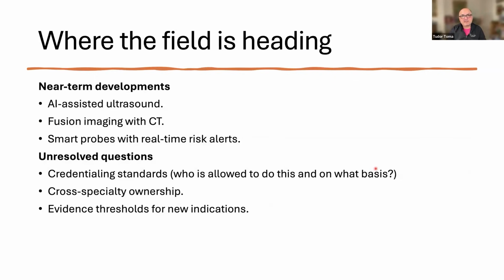A couple of words on where the field is going. So I mentioned AI. We now have an ultrasound machine which is giving AI-assisted instructions in terms of image acquisition, not only image interpretation. I think image interpretation is not very difficult, and you don't necessarily need AI to tell you that this is fluid, or this is a septated pleural effusion, or that this pleura is sliding or not sliding.